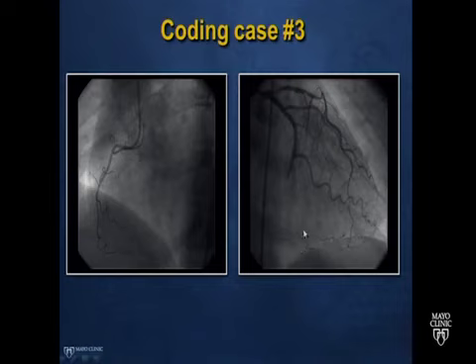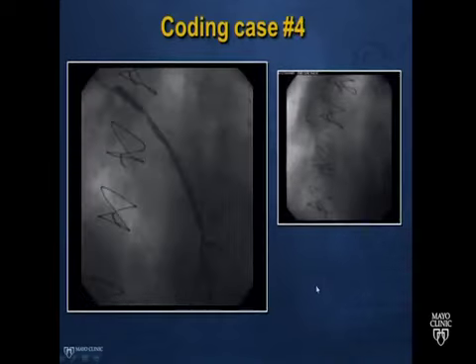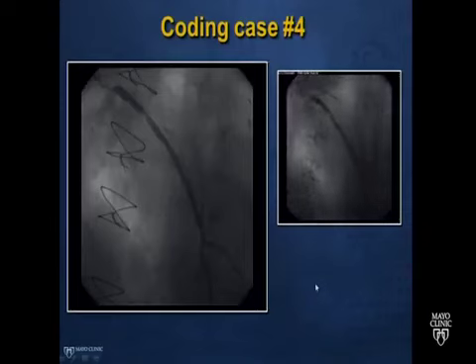And these collaterals, which are inferior, because remember, this is the inferior wall of the heart, these are left PDA collaterals. And we know that because this is a non-dominant right coronary artery. So these PDA collaterals have to be originally from this left circumflex. Move on here.